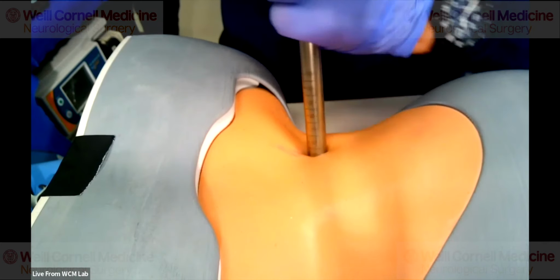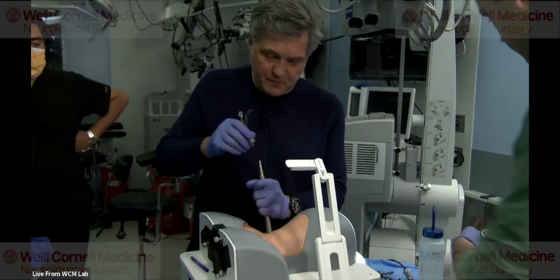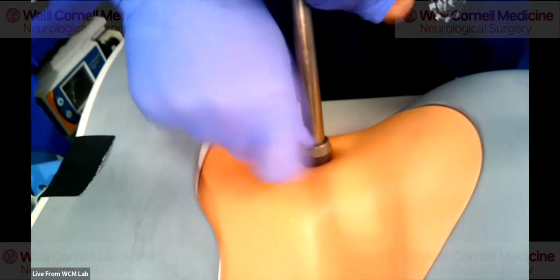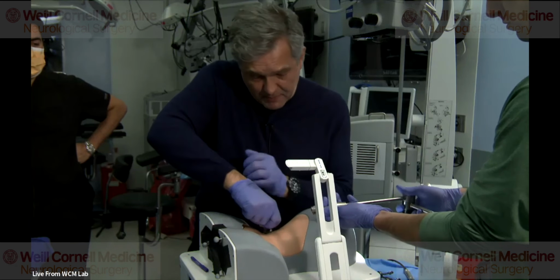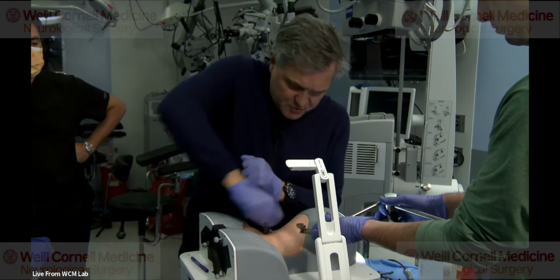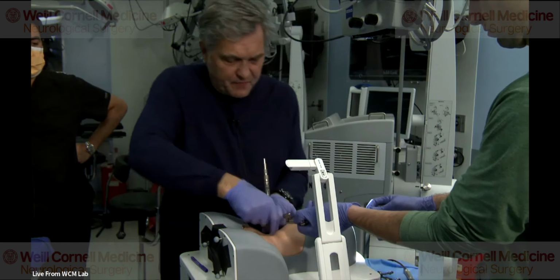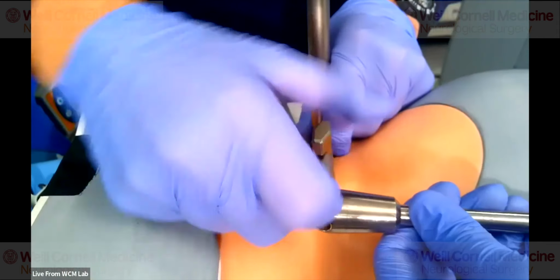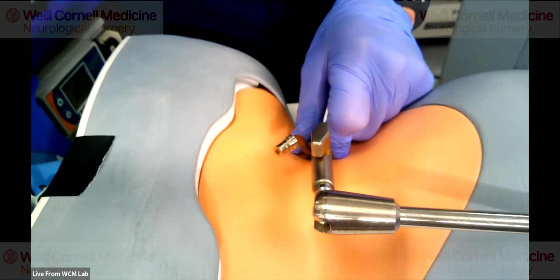Obviously, you always try to pick the shortest tube. So maybe you have 50. Yeah, let's try that one. So we put the 50 millimeter tube here. When you drop the tube, I always angle away from the spinal cord, because if you go medial, also in the lumbar spine, sometimes you hit the spinous process, and then you just can't put the tube in as deep as you would otherwise. So I angle away, and then I angle back medially. Now we attach it and then tighten it. We take the dilators out.